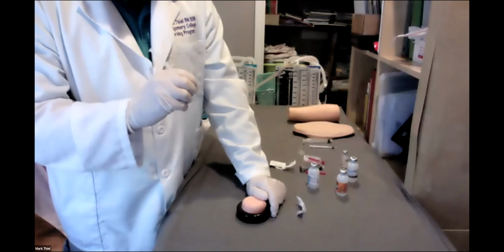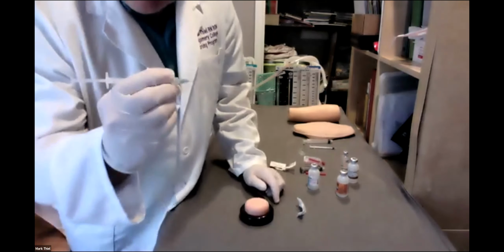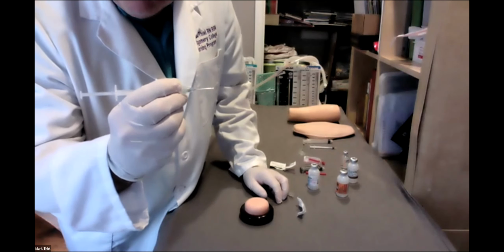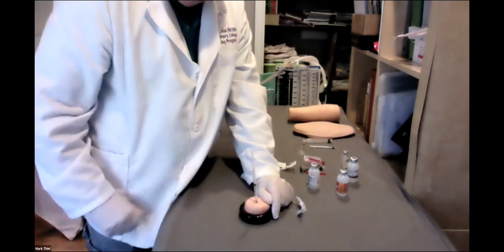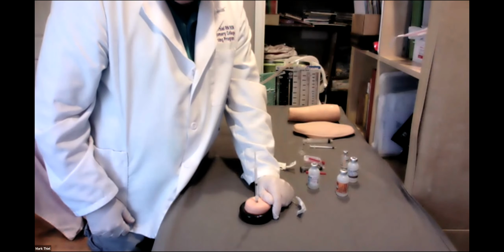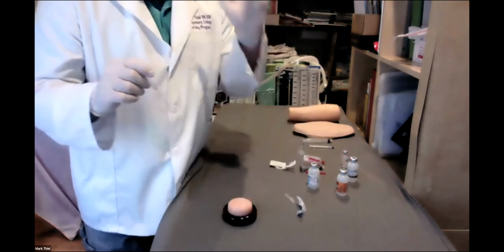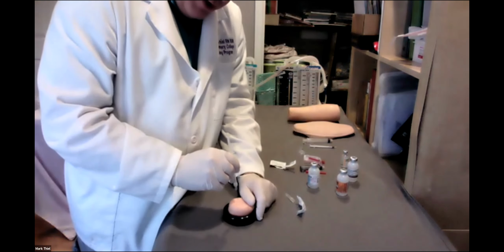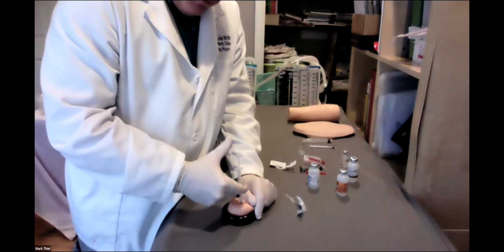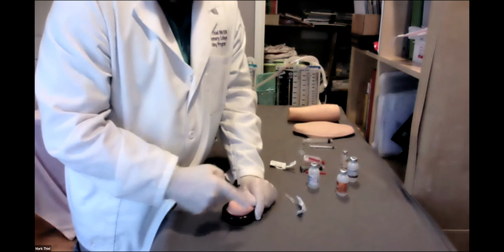It also plunges it deep into the muscle. We never leave metal needle exposed. We go right to the hub. You don't see that? Withdraw, release the Z. Now, in the plunging of the medication, we go slowly.